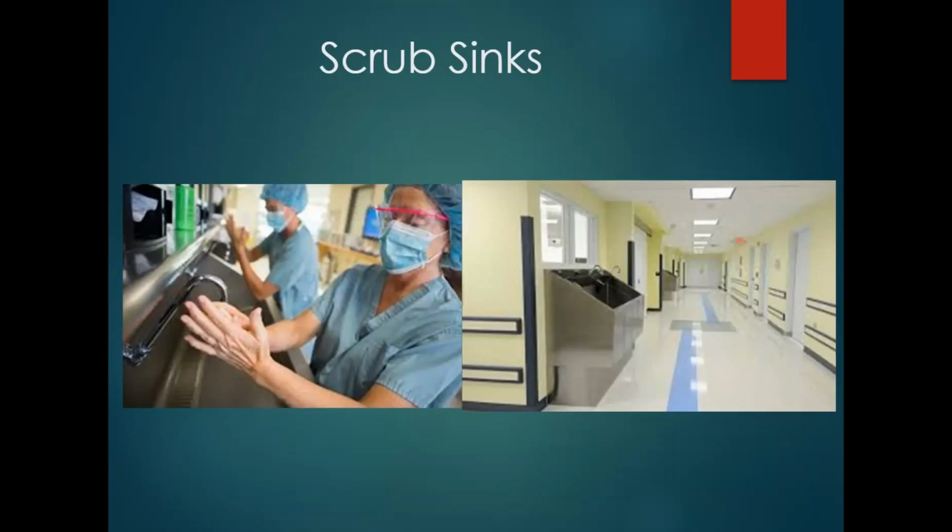Each scrub sink you'll find has an antiseptic hand rub. It has face masks, a face shield, your surgical mask as well, and protective eyewear. You can provide your own protective eyewear if you'd like. I have some students that prefer to take their own plastic goggles. The only thing is you do want to make sure that the shields cover the sides of your eyes, so that you have protection all around. Basic reading glasses are not going to be useful for your PPE.